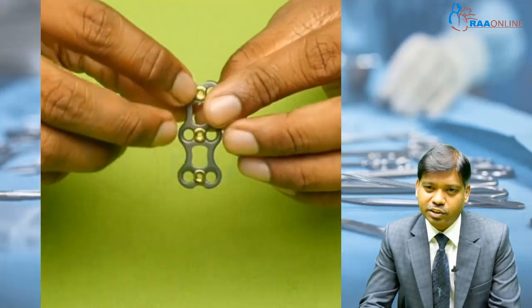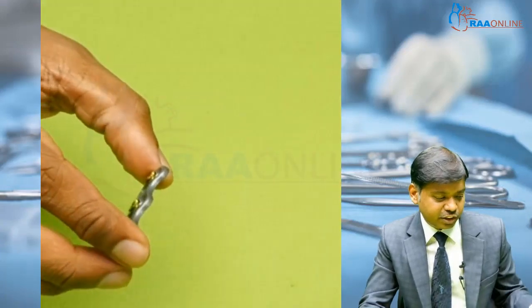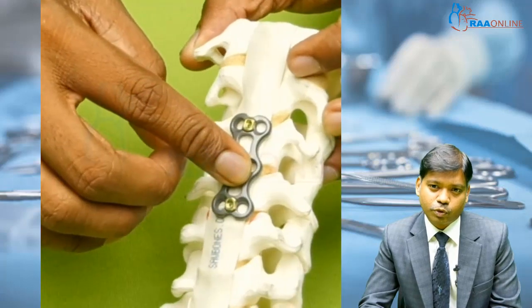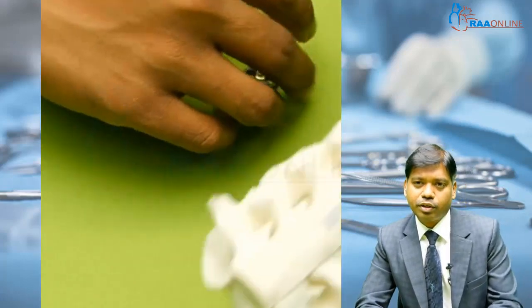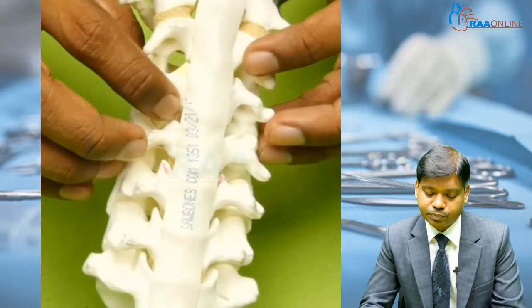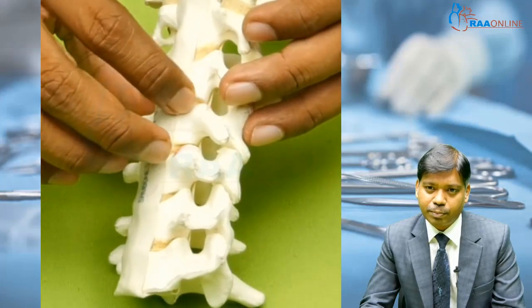I have taken just one of the plates here, and you can see the curve on the bottom surface of the plate so that it seats over the bone like this perfectly in a snug fashion. So this is how you place the cervical spine plate. In anterior cervical discectomy and fusion, you have to remove the entire disc, and the OPLL. Once you remove the disc, that portion will become empty.